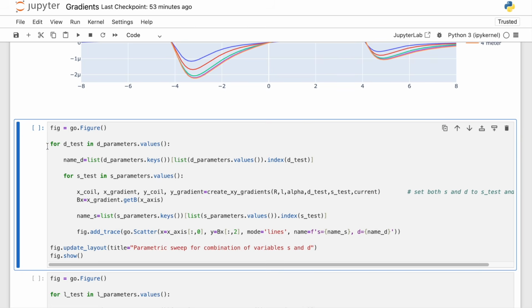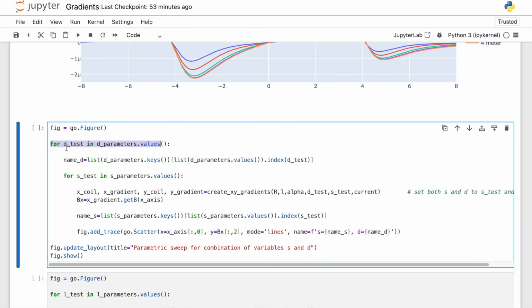So for that I will have two for loops, one let's say for D and the other for S, and my title would be parametric sweep for combination of variables S and D. And it's important to note that here, unlike in previous cases, now I have two variables which are with test. So this is done in order to make sure that both D and S change with these for loop iterations. So let's run this and see the results.